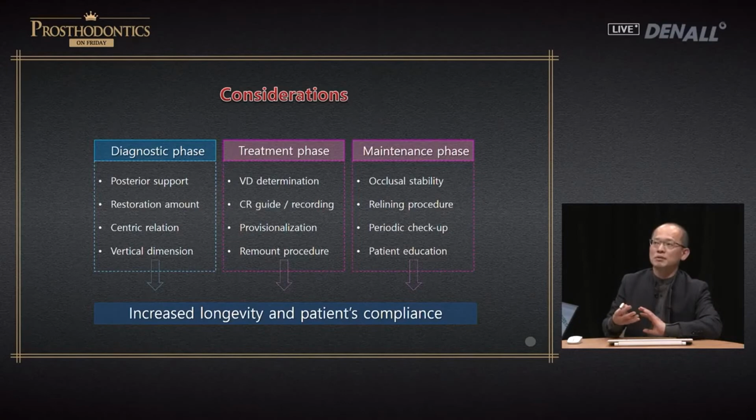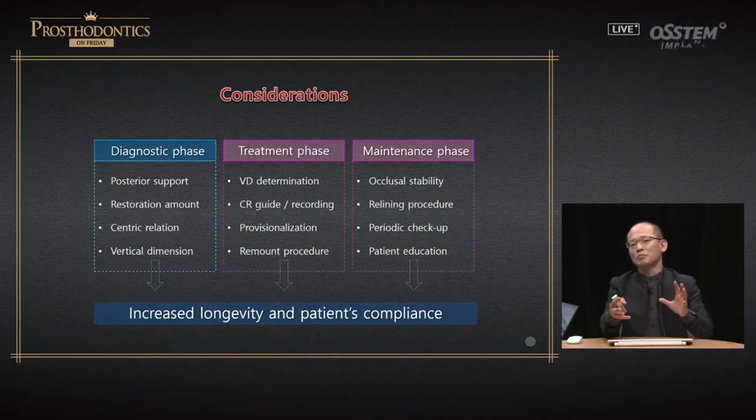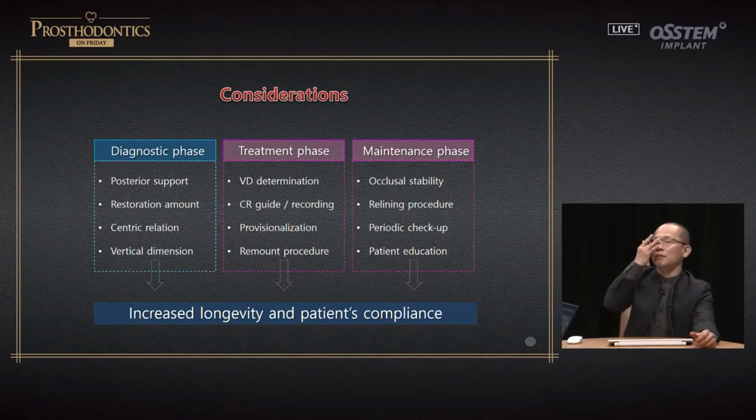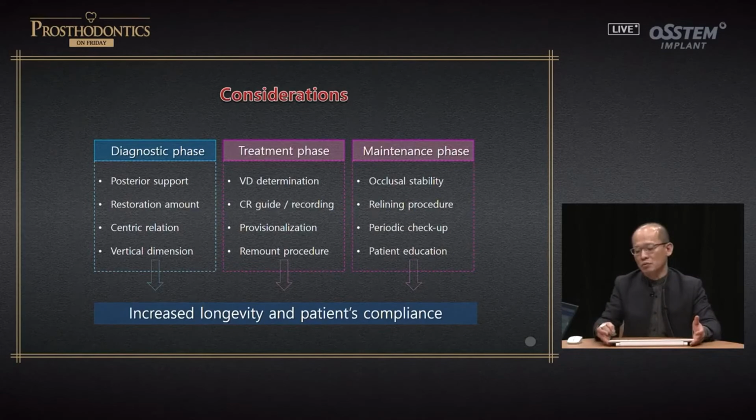I've been using gold, and it's been 15 and 20 years ago. So I know the result. And if you see a lot of articles, they have 20 years of cases also. So zirconia crown or bridge, rather than if it's combined with the natural teeth, how that changes the occlusion and how that needs to be approached is something we just have to see.